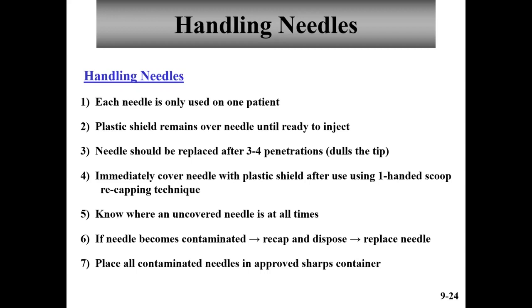Now, that same thing could happen if you go to inject the patient and you accidentally scrape the needle against equipment, against the bracket table, or it touches something. It's contaminated. You don't then put that in a patient's mouth, okay? So if a needle becomes contaminated, recap it, and then dispose of it in a sharps container. You don't put needles, even contaminated needles, in the trash can. They always go in a sharps container.